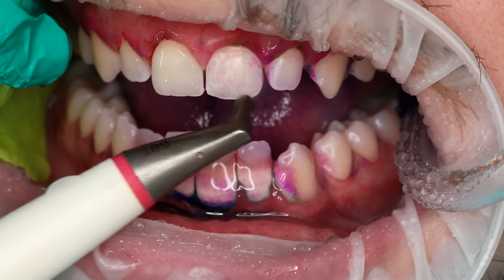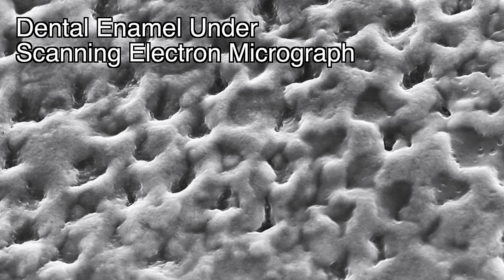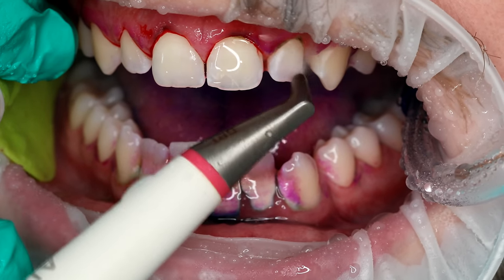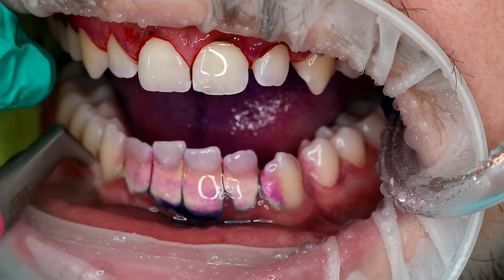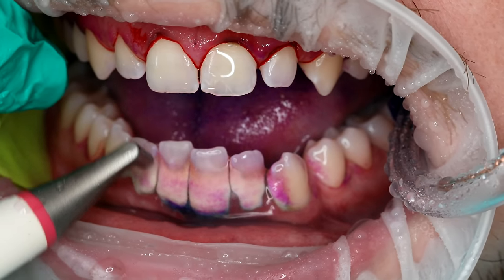is not a smooth surface. It's actually irregular in texture. So although the debris may appear to be gone, it will still exist in these microscopic pores. As mentioned previously, this device uses a combination of air, water, and that naturally occurring sugar called erythritol. Think of it kind of like sandblasting, but with your teeth. And instead of using sand, we're using a soft, natural sugar.